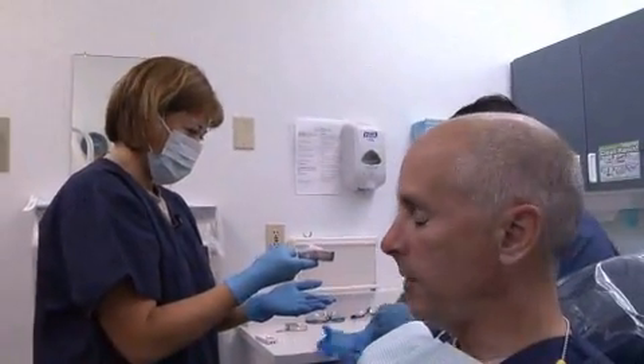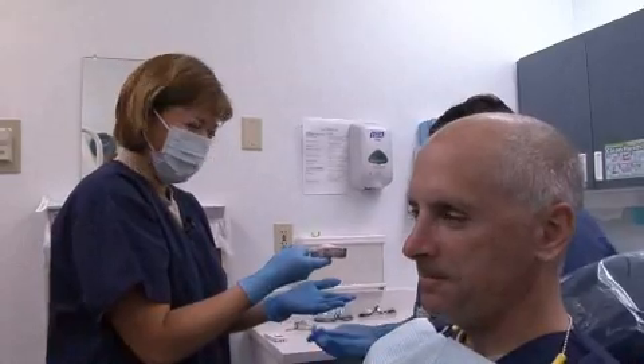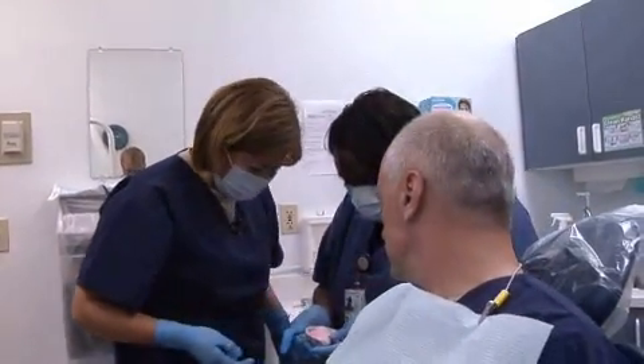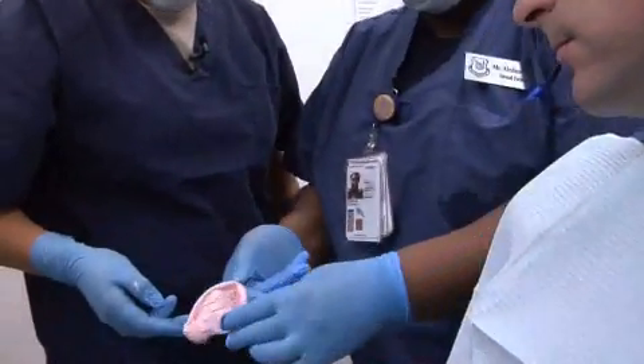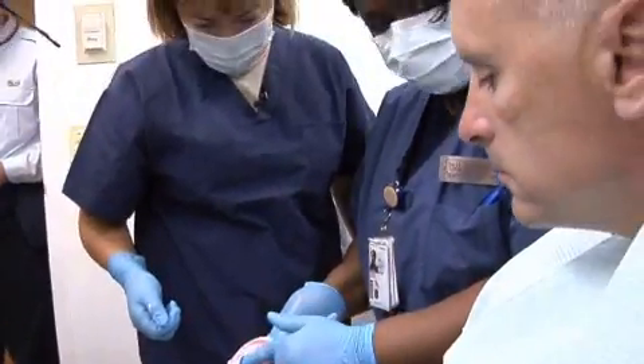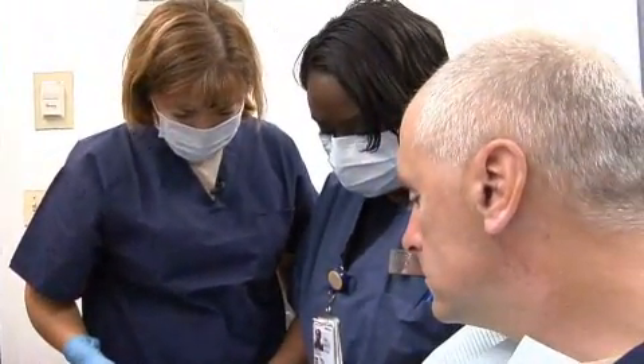It's better than being tased. Wow. So you just take a look and make sure we got all the way back to his molars there. Nice palate — good form of the palate. And we got everything we need.